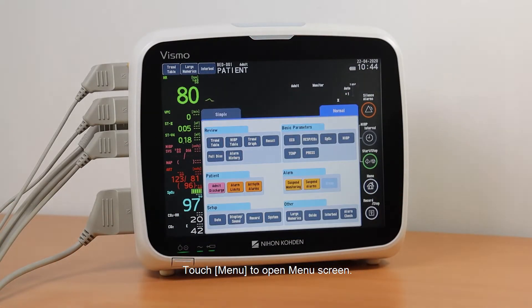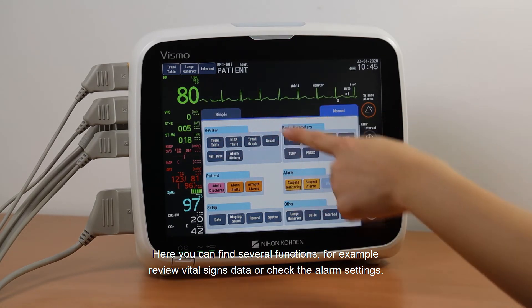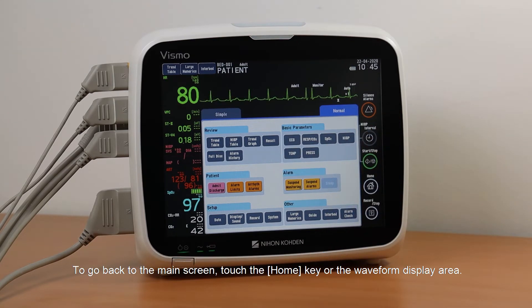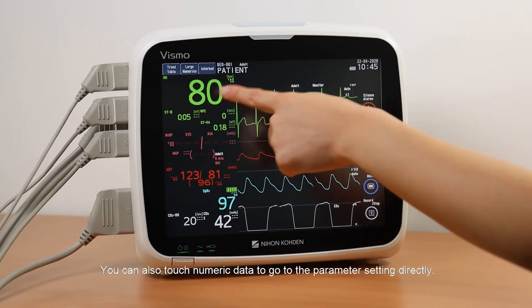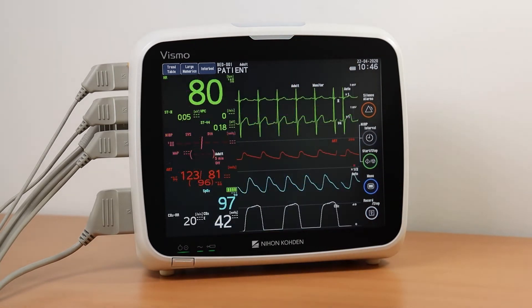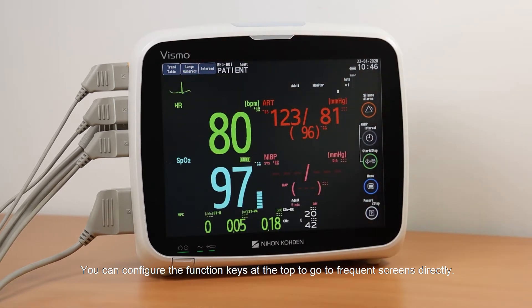Touch Menu to open the menu screen. Here you can find several functions, for example, review vital signs data or check the alarm settings. To go back to the main screen, touch the Home key or the waveform display area. You can also touch Numeric Data to go to the parameter setting directly. You can configure the function keys at the top to go to frequent screens directly.